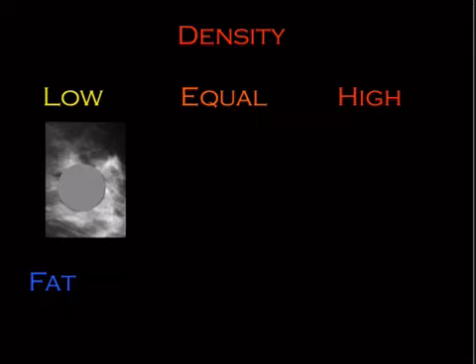Some breasts are very fatty, some breasts are very dense. And that's another thing that BIRADS will ask you to comment on that I'm not going to talk about, but just know that it is in their vocabulary that they will want reported, and the makeup of the breast tissue is variable.